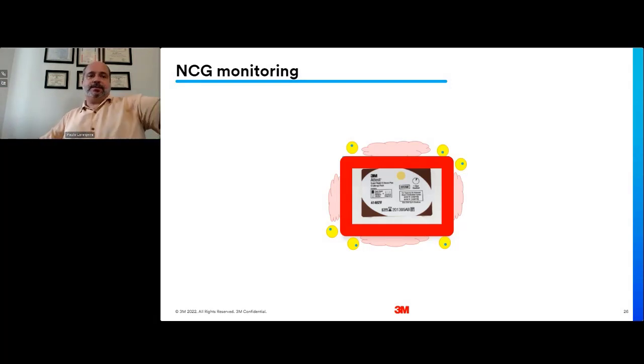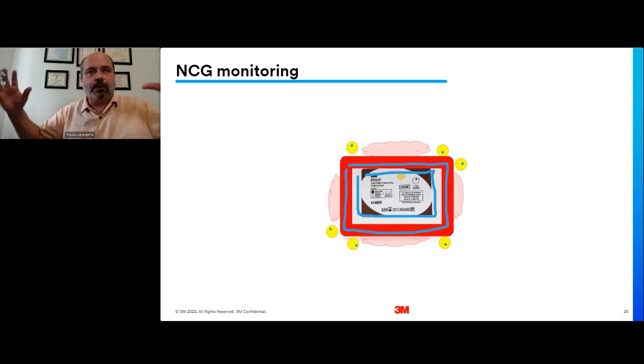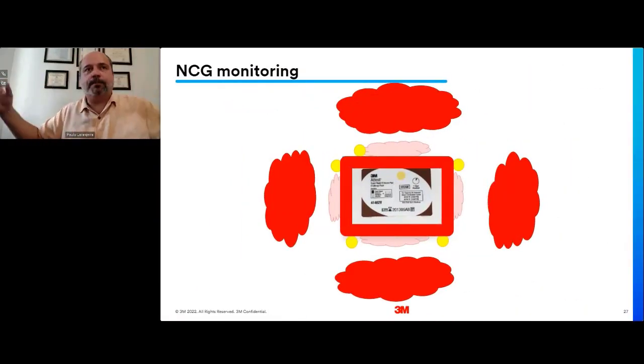Now, as it goes through the sterilization process, we are going to have a warmer area on the exterior, but we are still going to have a colder area. So steam is going to continue getting through the package, and it's going to be condensating inside of the package to a point and drawing more air. When steam condensates, it reduces in volume.